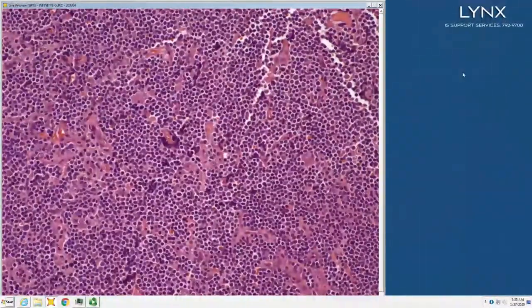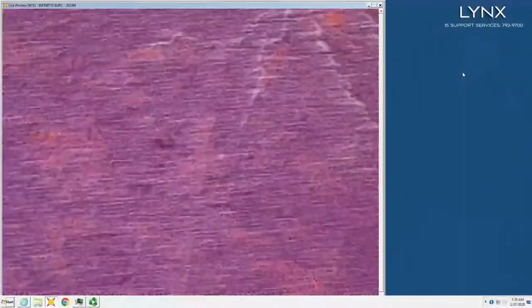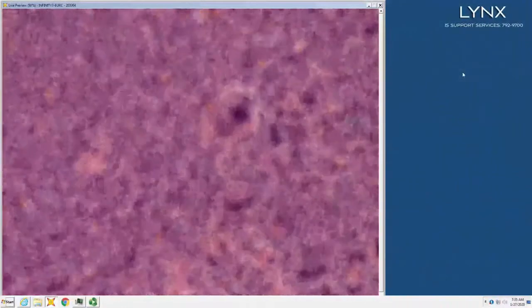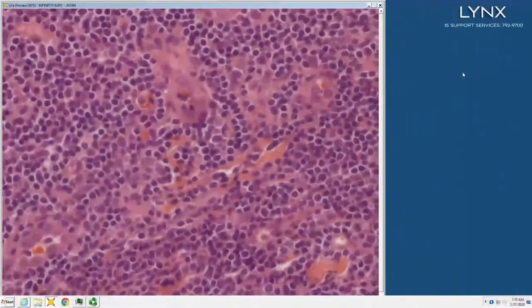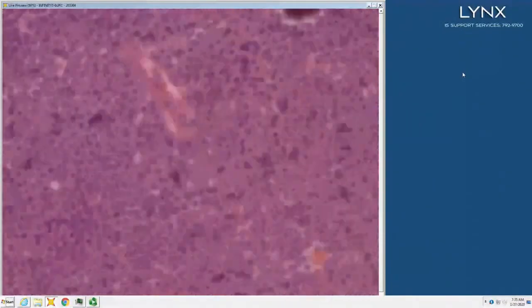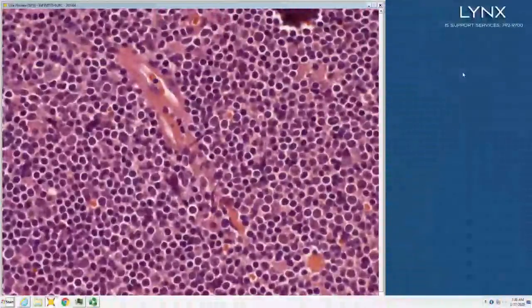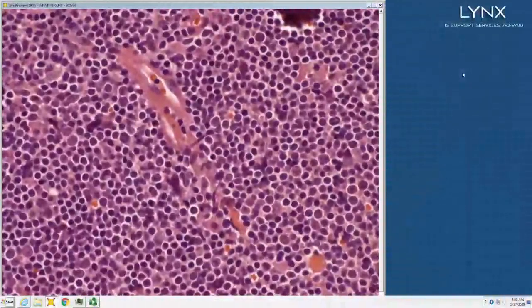There are also all of these squashed lymphocytes. Sometimes they're called carrot cells, or in Europe they call them spermatozoa-like lymphocytes, just meaning they're long and skinny. Right? Just means they've been squashed by the surrounding cells. That's a weird morphology for a lymphocyte, and that commonly is a clue to lymphoma.